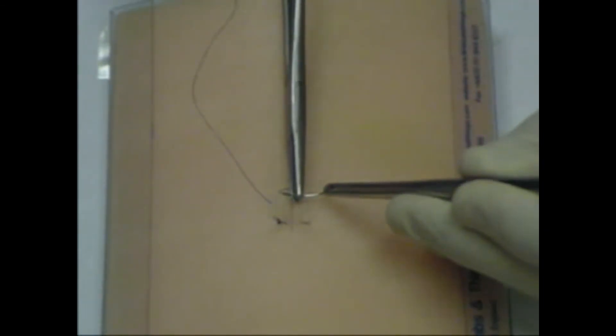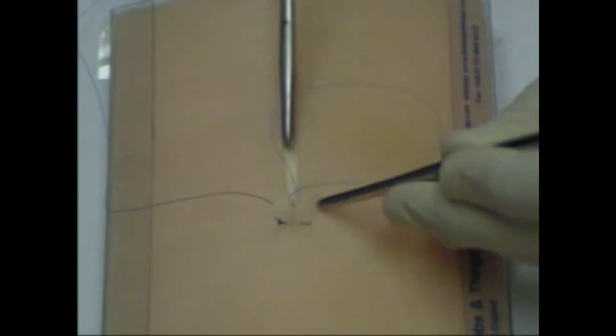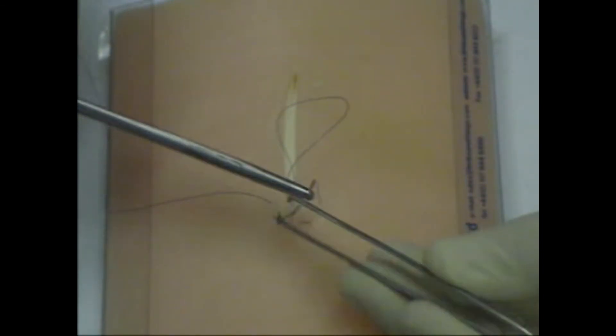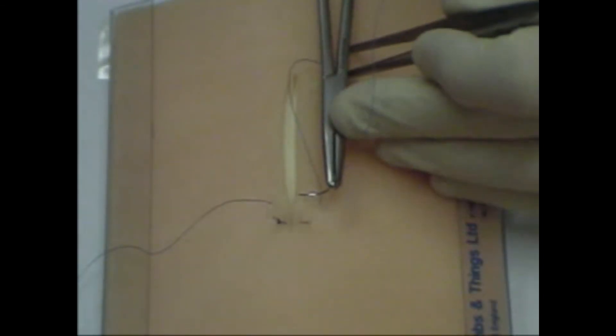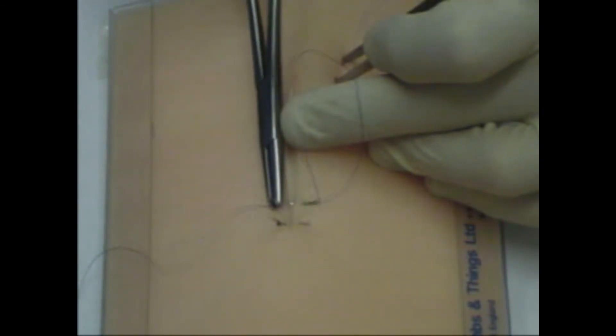Mattress sutures are used to prevent inversion of the skin edges, particularly where the skin is thin, such as on the back of the hand. A simple suture is inserted first, and then the needle is reversed. The needle is passed back through the two skin edges, placing these sutures very superficially. Monofilament nylon is being used with an instrument tie.